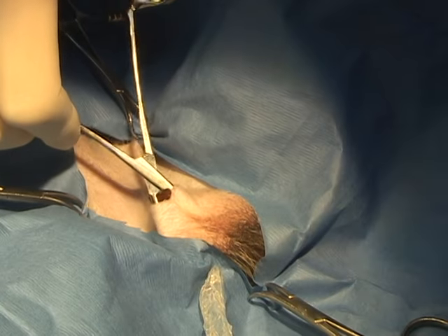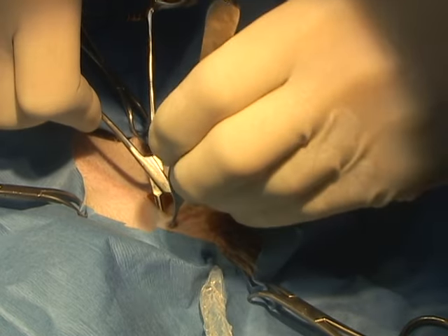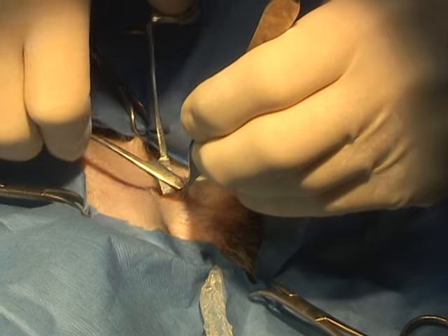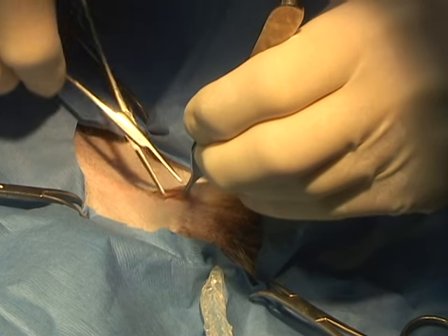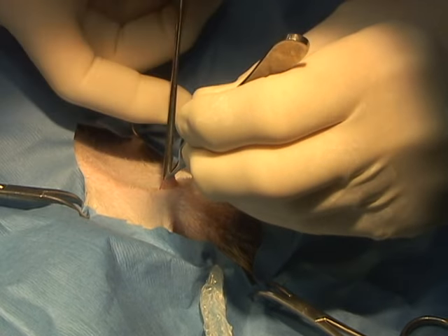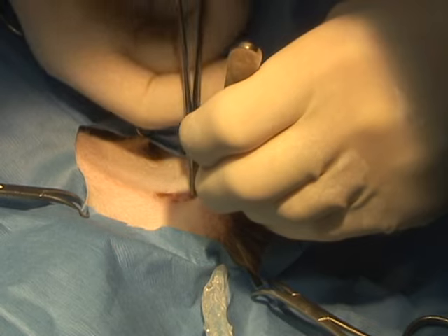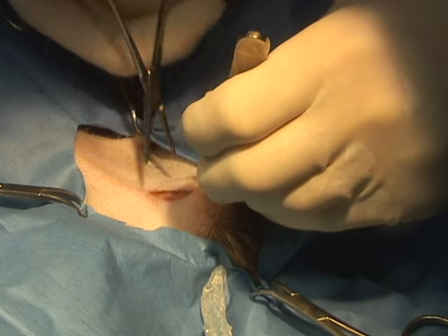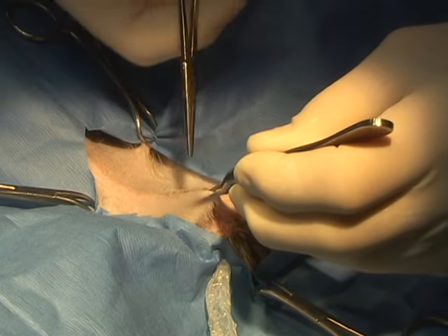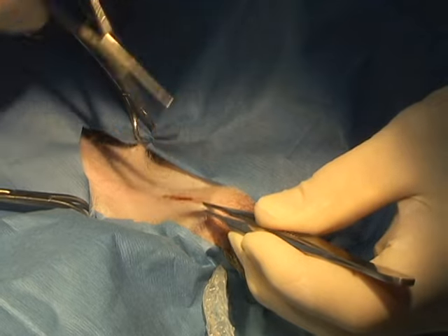In a case like this, we figure for maybe several weeks, the existing scrotum will have to stretch to accommodate the two testicles. This dog had a little bit of edema postoperatively, but within 3 to 5 days postoperatively, all the edema was gone, and both testicles were in proper position within, I would say, 7 to 10 days postoperative. We tried to keep the dog fairly calm after surgery, but this is a very, very busy dog. They do a lot of physical activity with this dog.